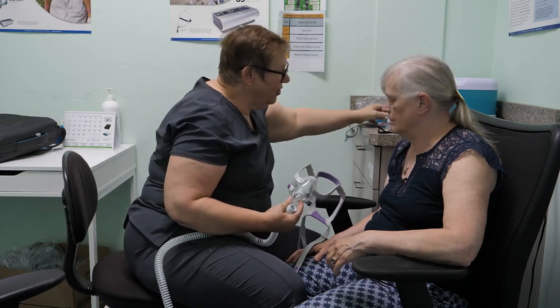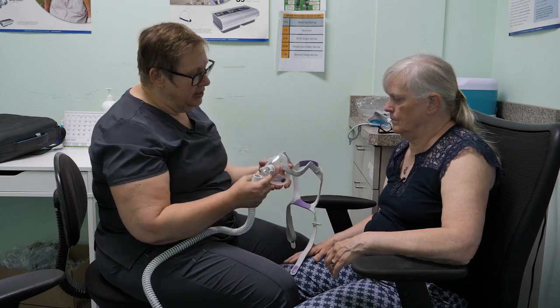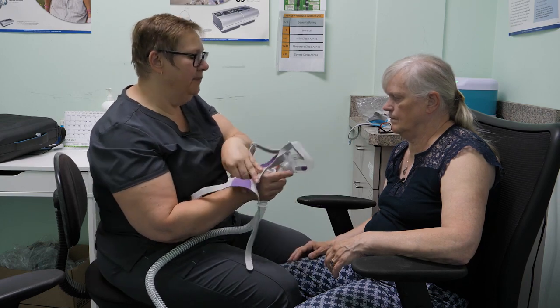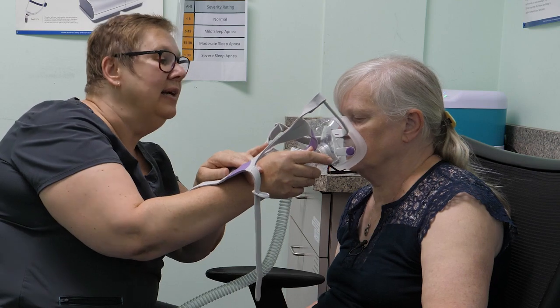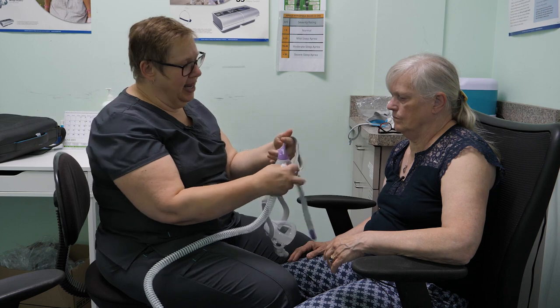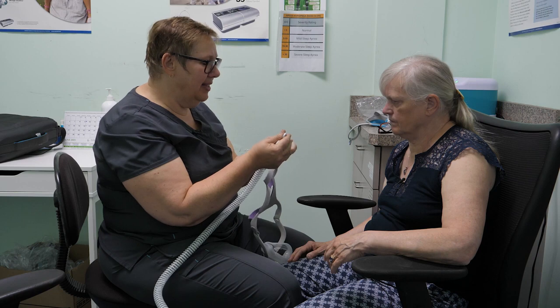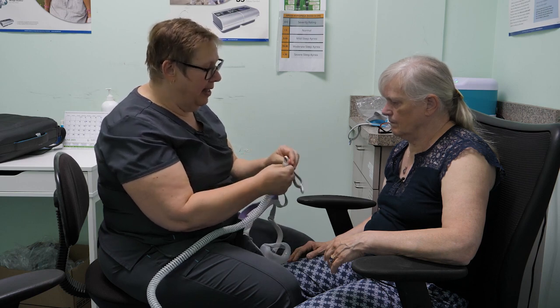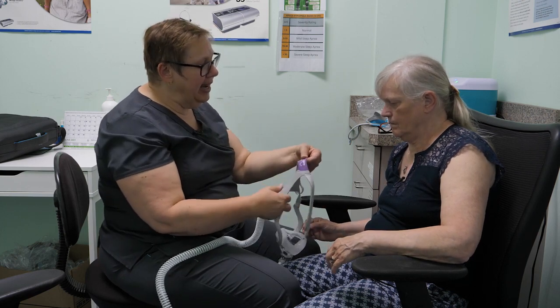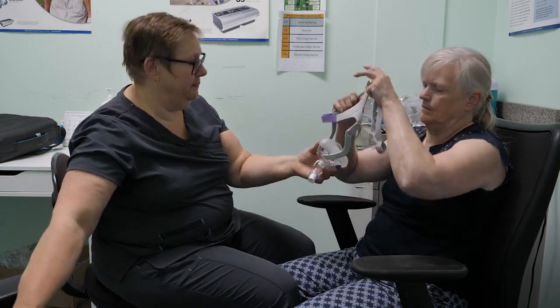Now we're going to try another one just so you can compare them and see how you feel on both of them, all right? So this one is called the F20, and as you can see, it's quite a bit different than the other one. So this one is going to sit just like that. Are you okay with that? All right. So again, you are going to put the headgear exactly on the same way as the other one. So you're going to hold it from the back of the headgear here. You're going to put the base at the base of your neck. And again, I do not want you to do up the clips, and I'm going to show you why in just one moment.